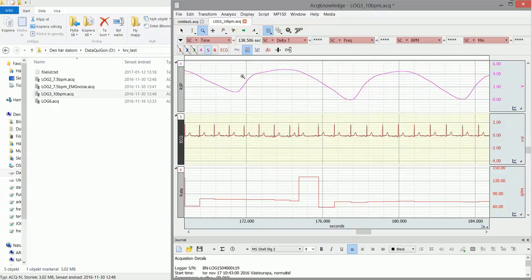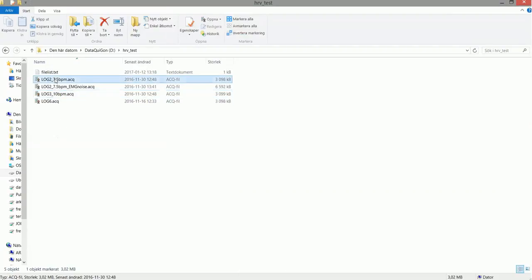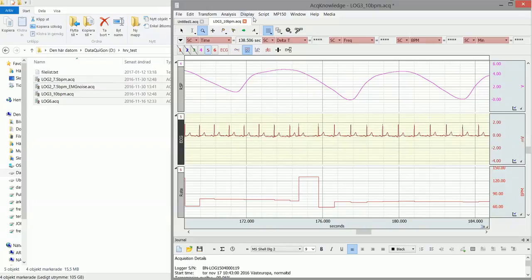You have a lot of files, and that's another thing. Here I have an example with a folder with just 4 files, but this could be 100 files. In scripting, you can use a script that automatically loops through a given folder and does the same analysis on each of the files, and then, for example, puts it out to an Excel sheet. And this is what I will show in this example.